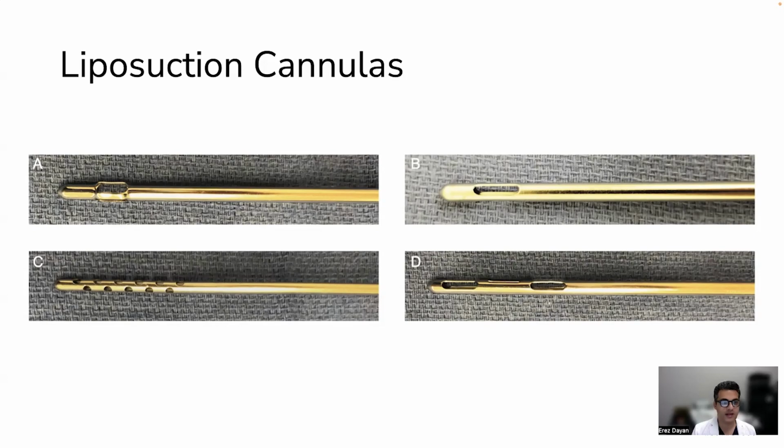So we just pass the basket cannula off suction to spread and disrupt the fat cells. Then you would aspirate. You can either use a tip like this, which is considered an accelerated tip because of all the holes, or a Mercedes tip, which is a little bit less aggressive. Usually we would use a 3 or 4mm cannula, depending on the patient, to aspirate.